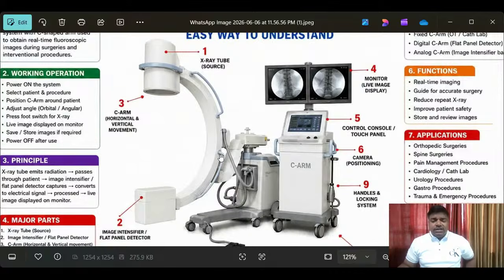and every part. Because first of all, as a biomedical engineer, I'm explaining in the work area, not the college area. When you are going to do the job, before entering the job, you have to know all these basics of the medical equipment. If you are a junior also, please try to learn and keep it in your mind. Whenever required, then you can perform all things.